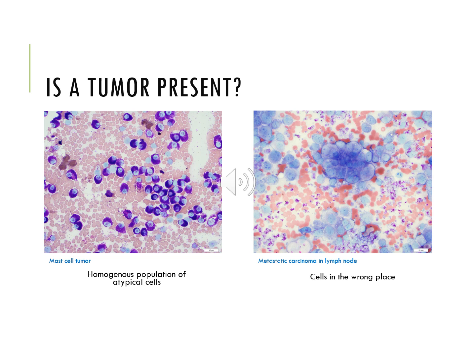On the right, this is a picture of a lymph node aspirate, and in the middle there, you have this cluster of really ugly, cohesive epithelial cells. They have pretty marked criteria of malignancy. And besides that, there are epithelial cells in the lymph node, and you should never have epithelial cells in a lymph node. So that tells you right there that there's metastatic disease. And so these are the two big categories: primary disease, where there's a primary population of atypical cells, or metastatic disease, where it's spread from elsewhere in the body.